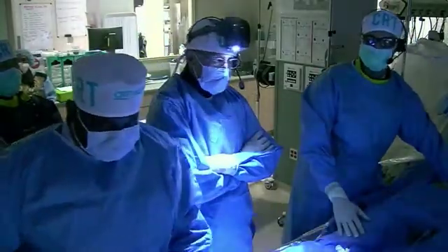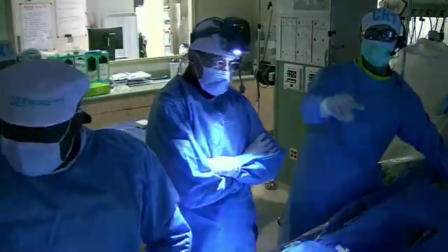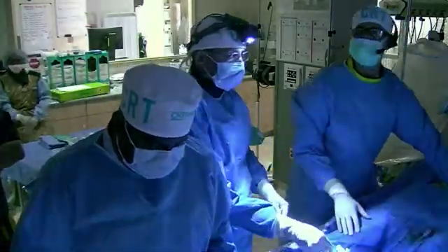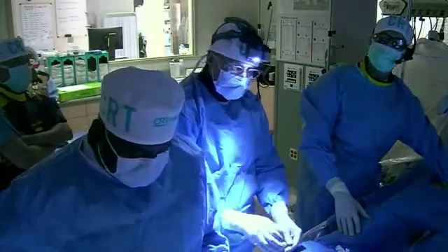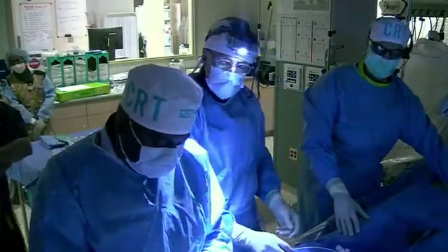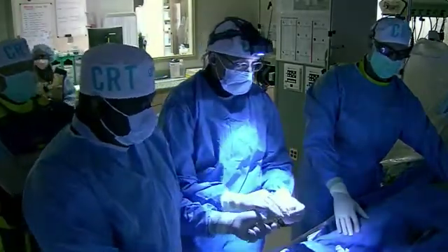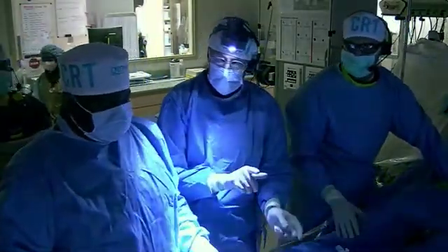Well, you can use the shockwave balloon without applying the energy and see what it does at low pressure. 100%. So let's get a 3.5 intravascular lithotripsy. Ron, can I interject something? Please. I do a lot of shockwave in the lower extremities. In my experience, we do a lot of shockwave.